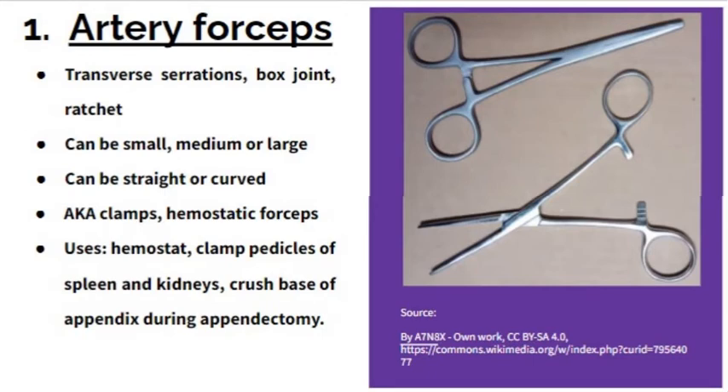The first forcep is the artery forcep, which has transverse serrations on its jaw. It has a box joint and a ratchet lock. It can be small, medium, or large in size, and it can be straight or curved. It is also known as a clamp or hemostatic forceps.